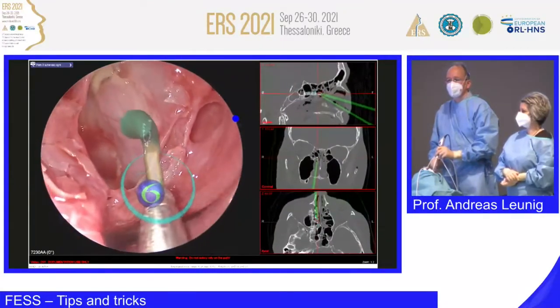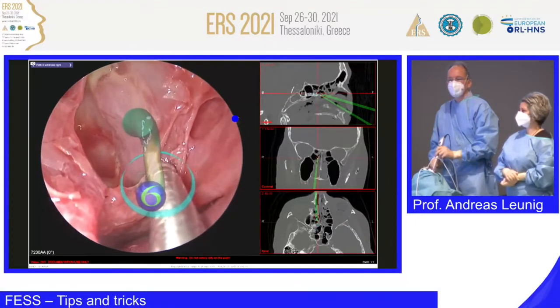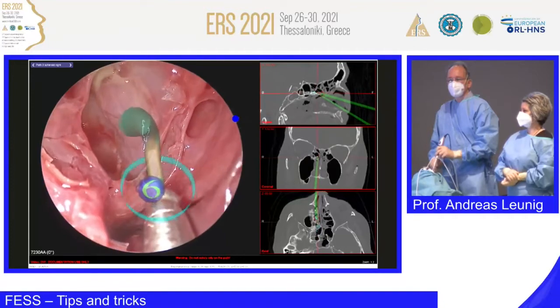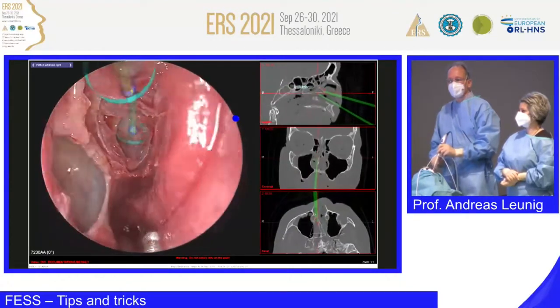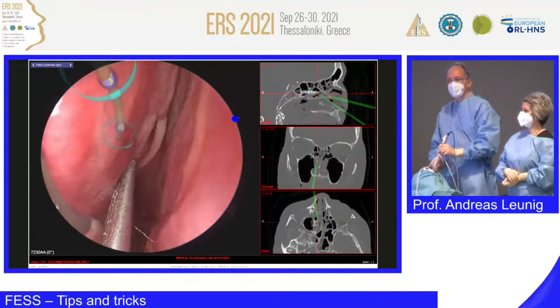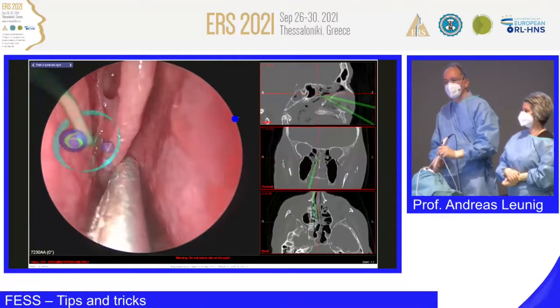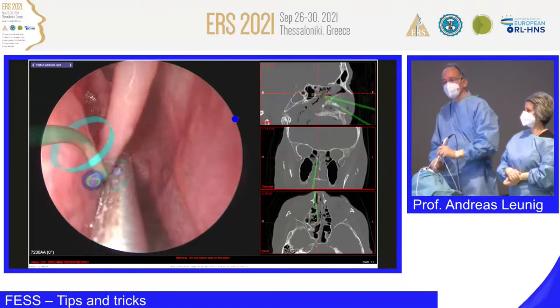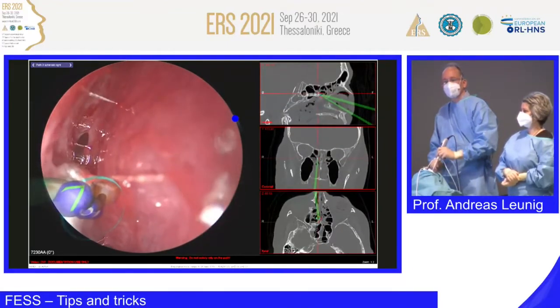So this would be the transethmoidal approach in the direction of the sphenoid sinus, or you're using the transnasal one. I'm coming back. I'm going between the middle turbinate and then coming here to the supraturbinate. And here we are. That's a natural ostium.